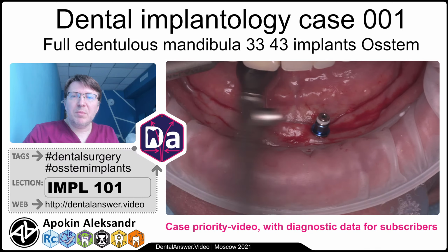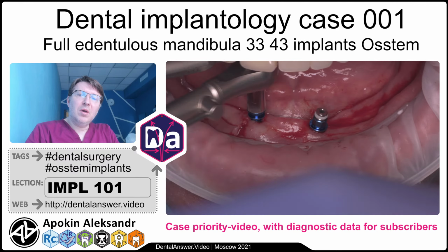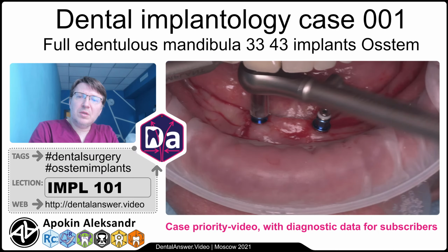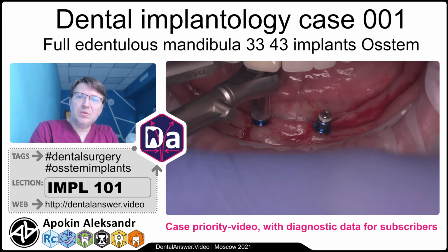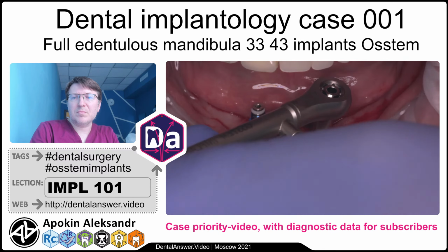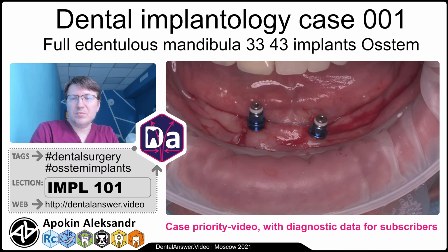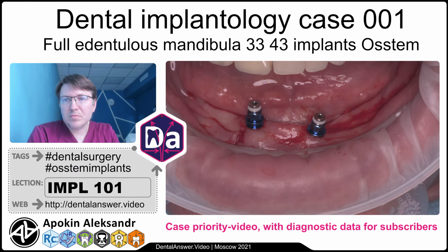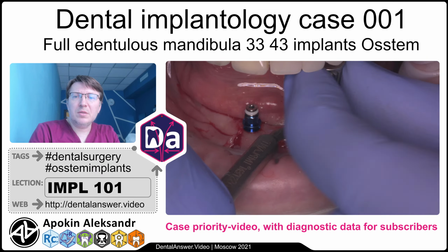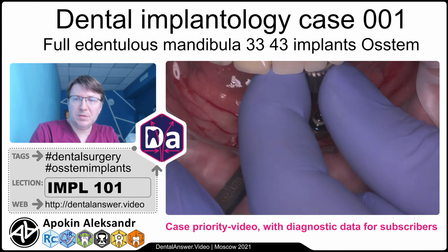But this dynamometric key also shows me the near-physiologic amount, 30 Newtons. Good. This is the holder to avoid movement of the fresh implant during insertion.